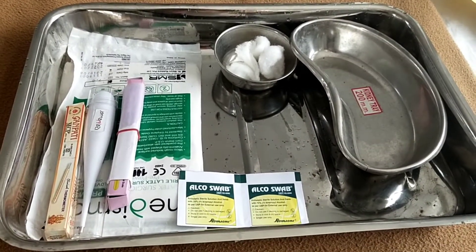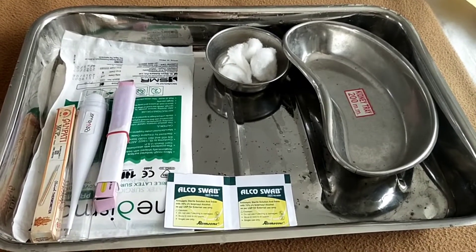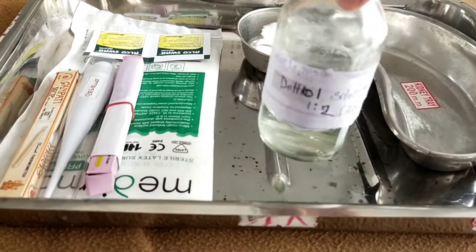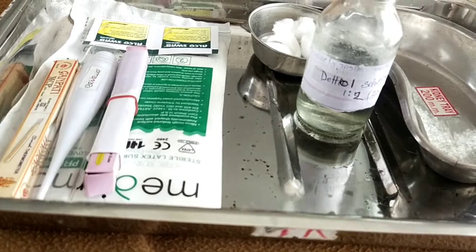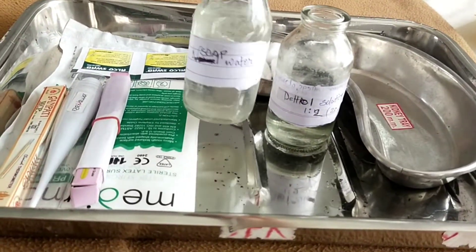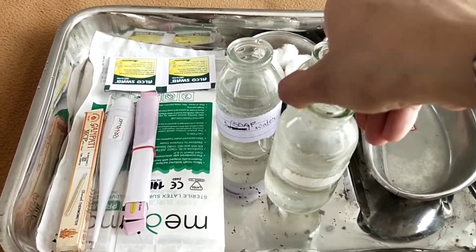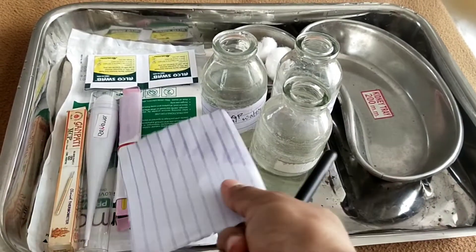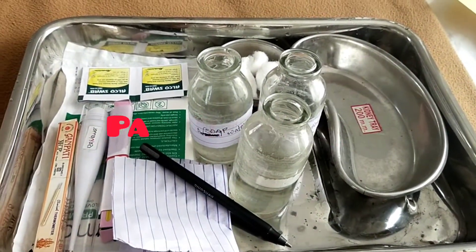If alcohol swabs are not available, then you should take three bottles to contain disinfectant solution and one with normal water. I make the Dettol solution into a Dettol solution bottle. Next, I take a soap water bottle.